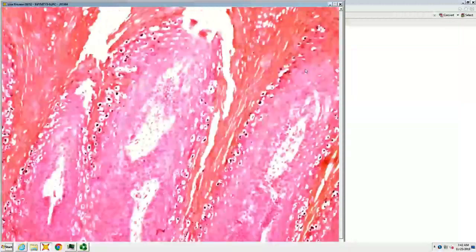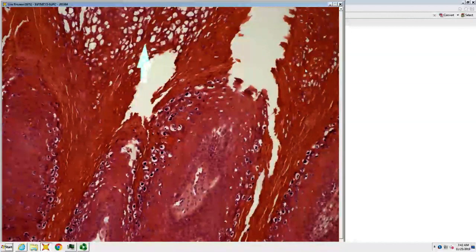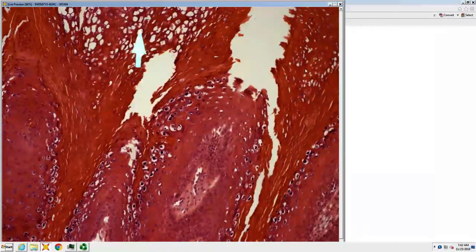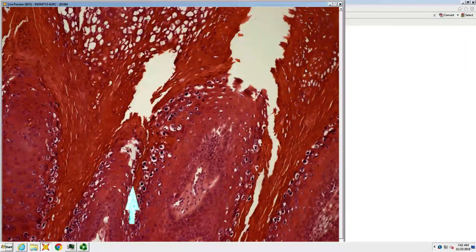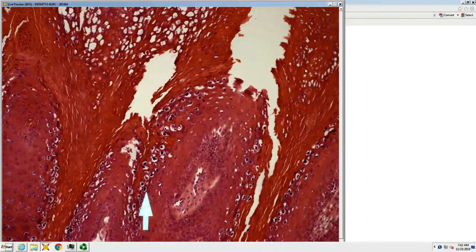So you have the coarse basket weave. Looks like someone has taken a little 2mm punch and punched holes in a compact corneum. Do you see any koilocytes? Just a few here, right? So koilocytes should have a little crenated, raisin-like shriveled nucleus and a white space around it. On cervix, they're very strict with that definition for pap smears.